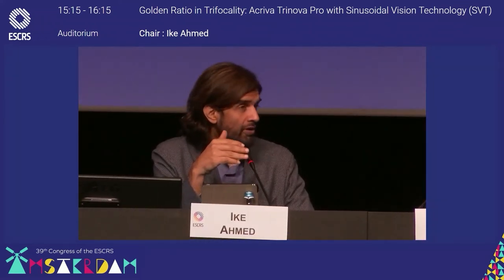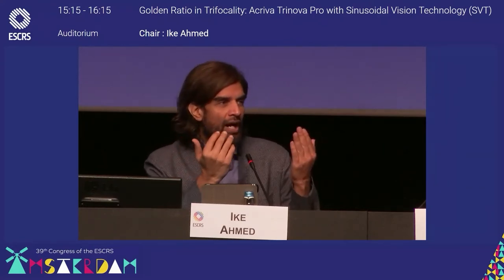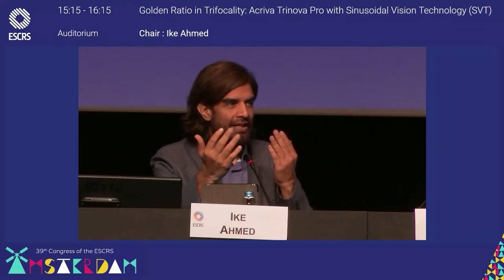Yeah, I know many people have success with mixing and matching, so I cannot poo-poo it too much, because some people really like that, and they do it because they want to have maximum contrast and distance in a dominant eye, and maybe do a trifocal in the other eye. I get that. We used to do that, for example, when we had bifocal multifocal lenses, where we would do a closer add in one eye and a low power add in the other eye to get a range of vision.